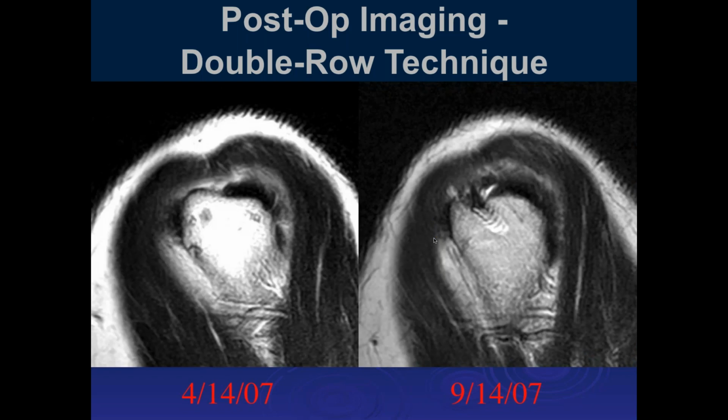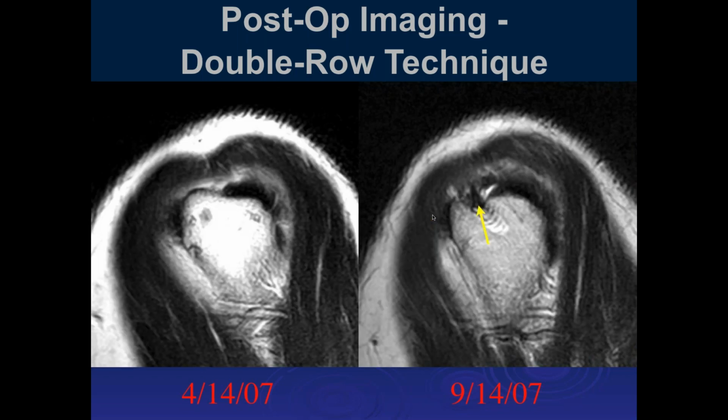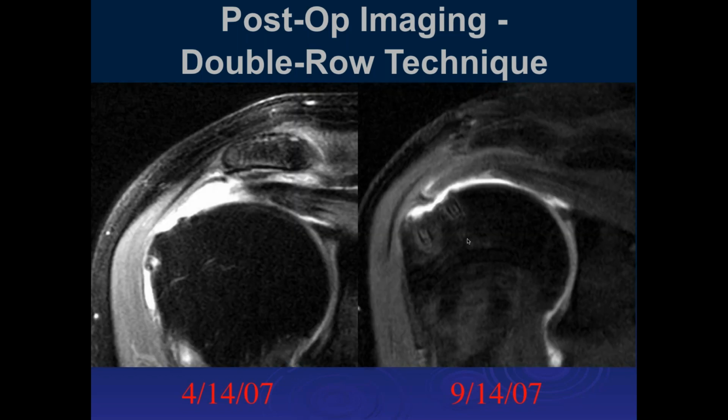Is that fluid normal there between the tendon and the suture? Right in through here? Fluid, yes. No, you'd like not to see that fluid there. So there we can see, and then that just shows the tear. And can you pull that back, John? Yes. That last. Yeah.